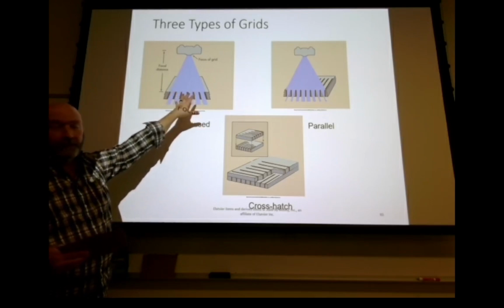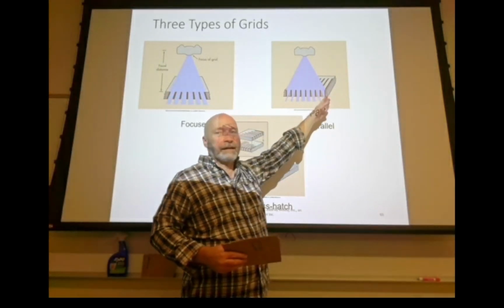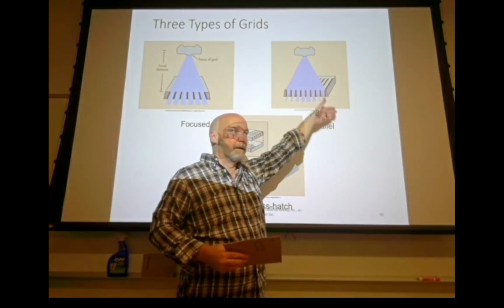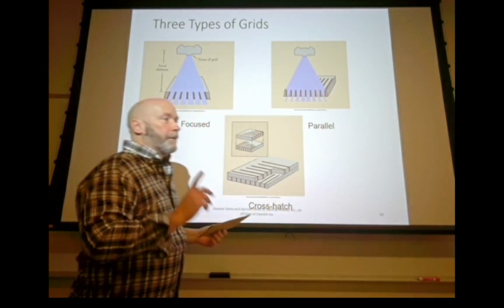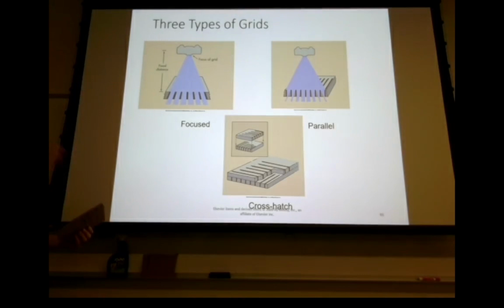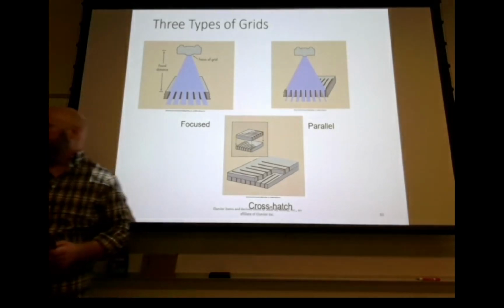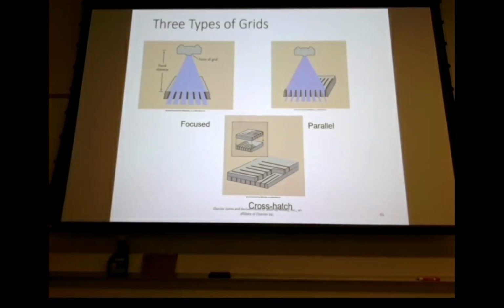They're very good at cleaning up scatter radiation, especially not getting that scatter or the grid cutoff in the periphery. The problem is not just exceeding that focal range, getting too close, too far away, but also, let's say, let's turn this back off again.